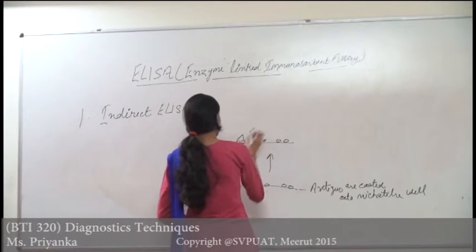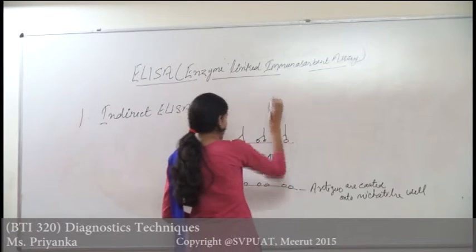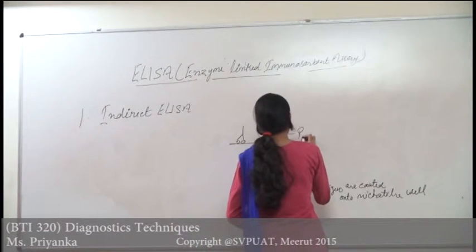Then the sample containing primary antibody is applied to the wells. The antibody is bound to the antigens.